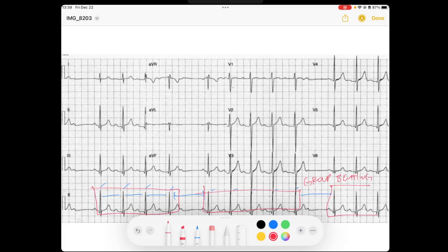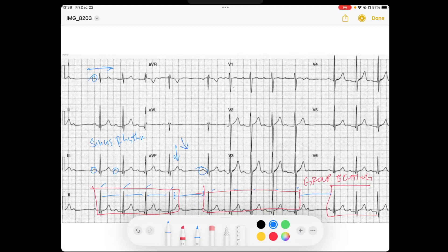Group beating should make you think there may be some type of AV block. Let's do our normal evaluation. First, what is the atria doing? I see nice P waves. My P wave is up in lead 1 and up in AVF, so I can say this is a sinus rhythm — because if it's up in lead 1 and AVF, it's going down to the left, meaning it's likely coming from our sinus node.